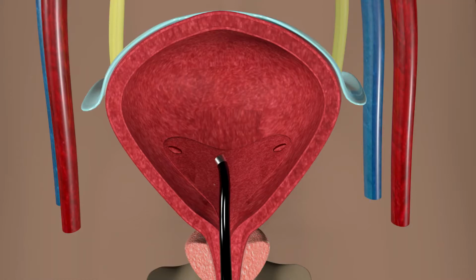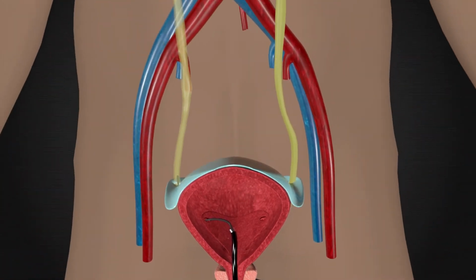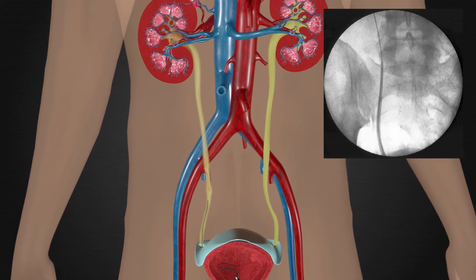Once we are inside the bladder, we will find the opening to your ureter, which is the tube that drains urine from your kidney to your bladder. Once we have found it, we will place a wire into the opening and use X-ray to watch as we advance it to the level of the kidney where the urine first collects.